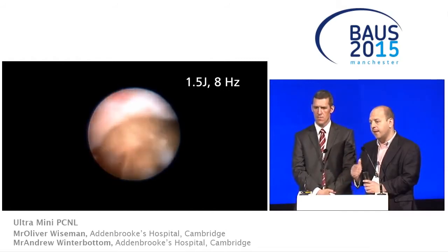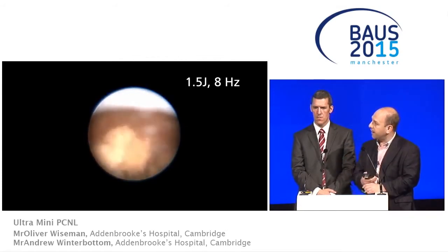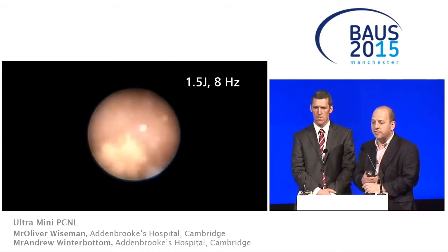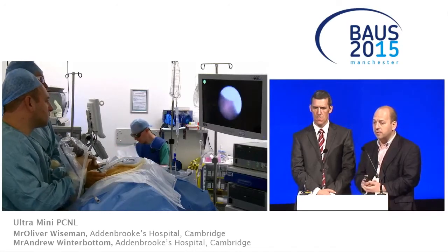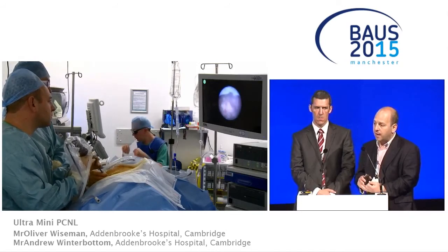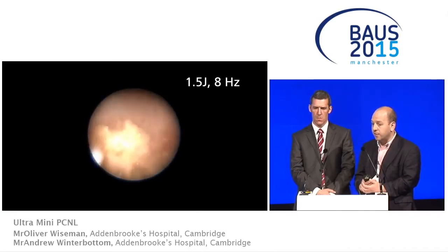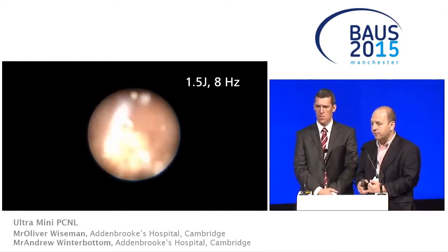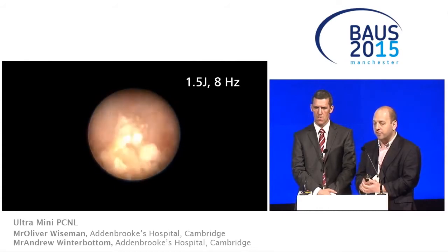Well, the big advantage is that the access size is much smaller. In fact, we've collected data on all the ultra mini PCNLs done in the UK up until December of last year. There were 32 done. There were no transfusions, and 28 out of the 32 patients went home the next day. Analgesic requirements are much less. There's no requirement for a nephrostomy tube post-operatively in the majority of those. We haven't collected the data, but on the 4 patients that we've done, their analgesic requirements post-operatively were much lower.